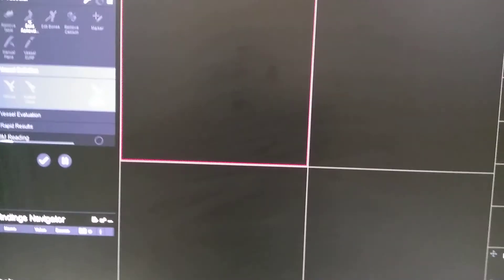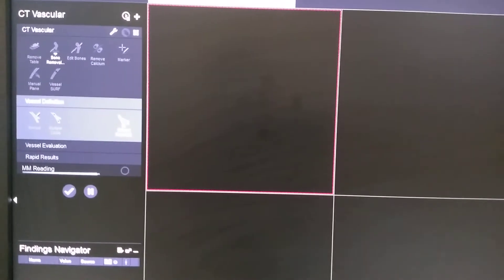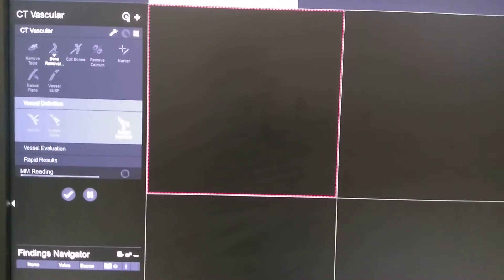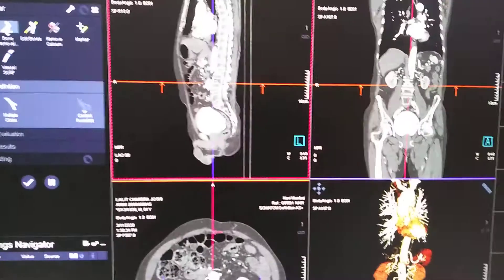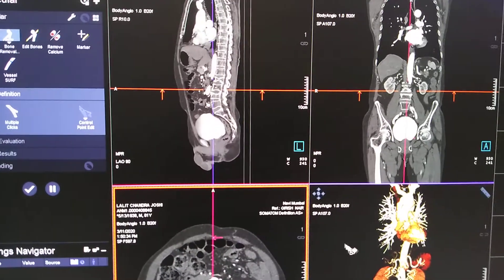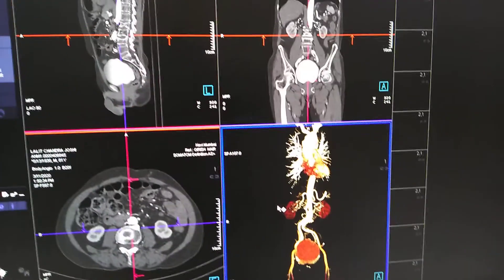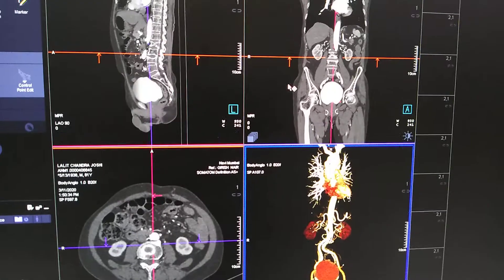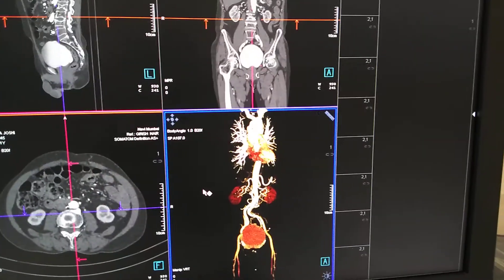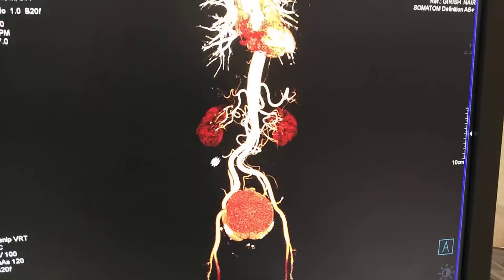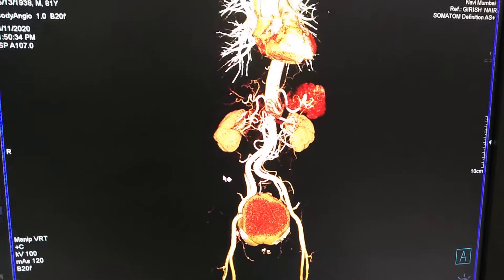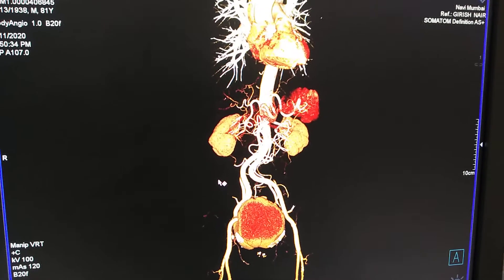This will take a little more than 1 or 2 minutes. You can see the sagittal, coronal and axial images as well as the VRT here.